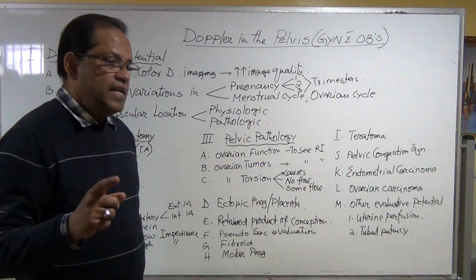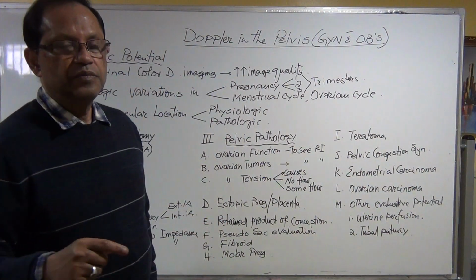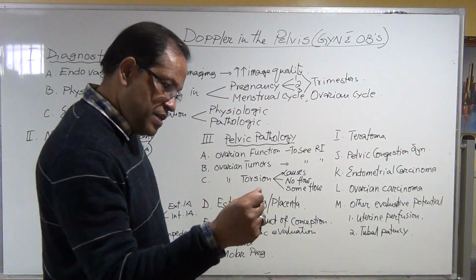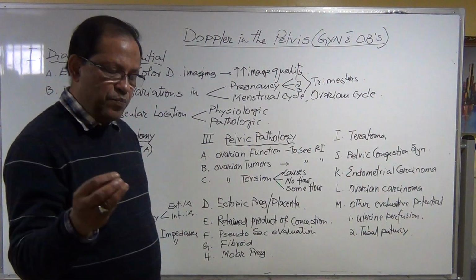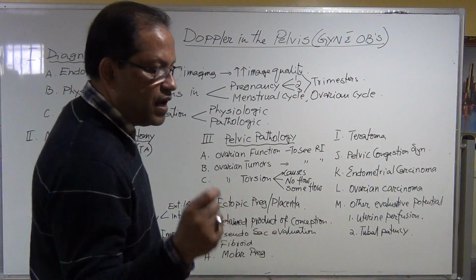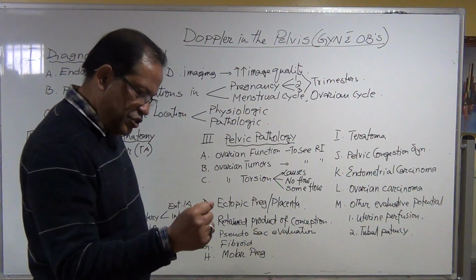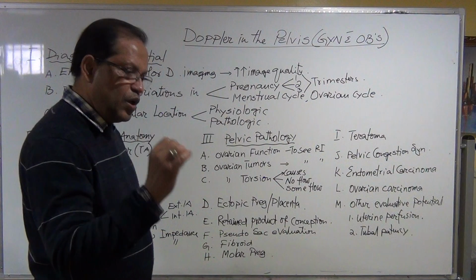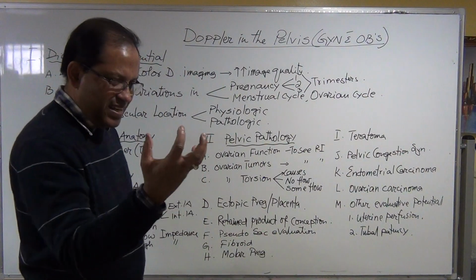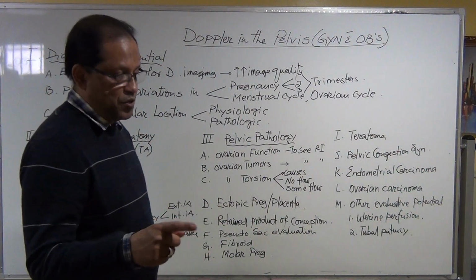And you also need that to kill the fibroid, to stop the nutrition or blood flow to the fibroid. There is a procedure called embolization, microbubble embolization. They introduce the foam, the micro bubbles, into the feeding artery with the guidance of ultrasound and the Doppler application. And they inject that foam and the blood flow will be shut down, and gradually the tumor will be regressing and compromised. It depends on the type of tumor.